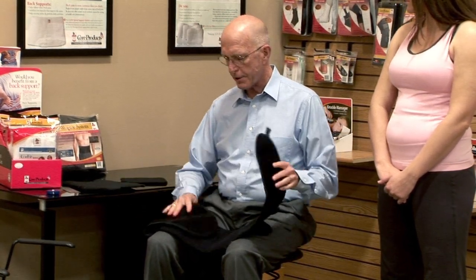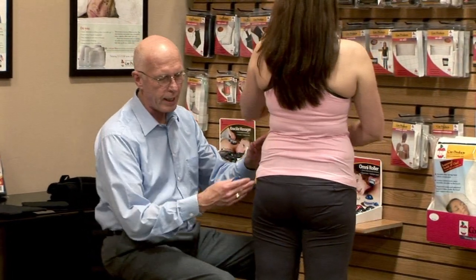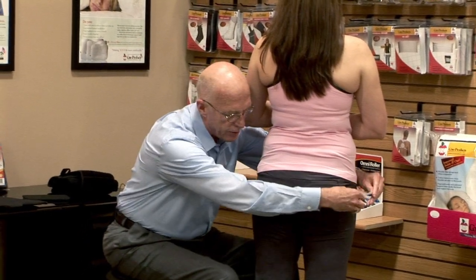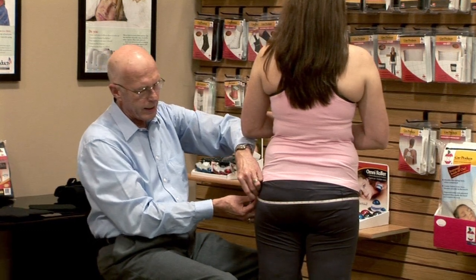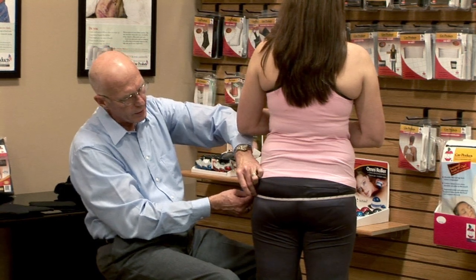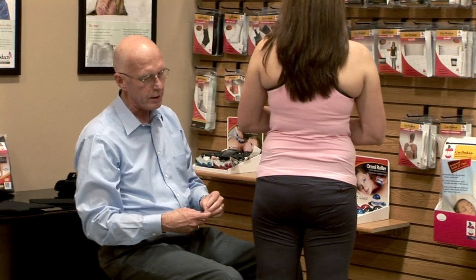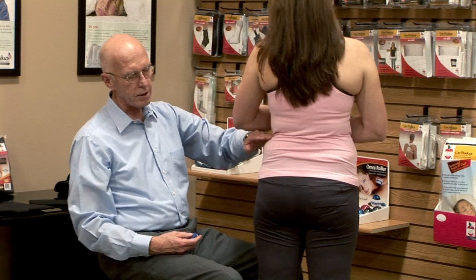We'll go through the fitting process, talk about how it's customized to the patient, and cover patient education. We're going to start with measurements. You want to see the patient from the side — not the front or the back — so you can see the fullest part of the buttocks. Measure at that fullest part, and really crank down to get a very snug hip measurement. You'll also want, for your medical documentation, a waist measurement taken above the crest of the ilium, below the costal flare.